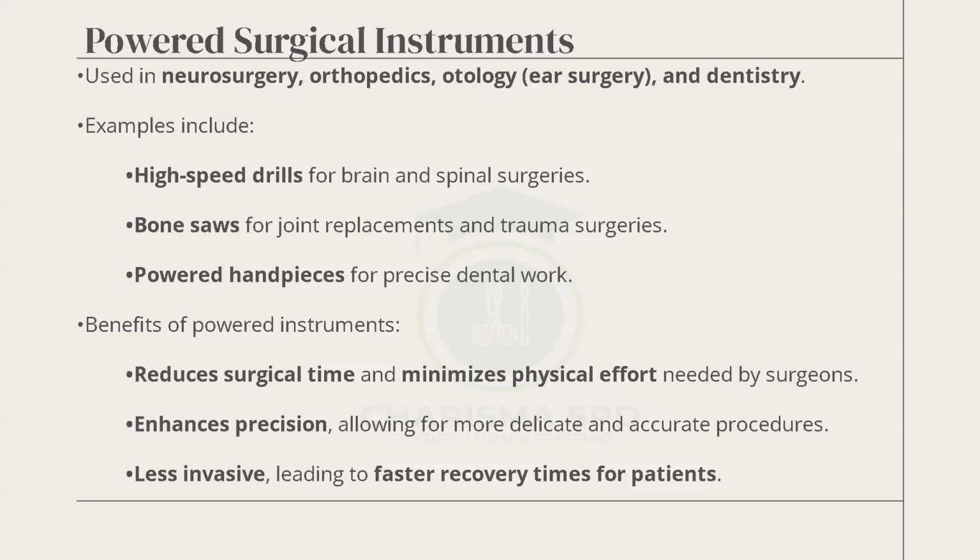So when you use these complex but powered surgical instruments, surgery is done in quick time, in record time. Recovery is also what? Done in record time.